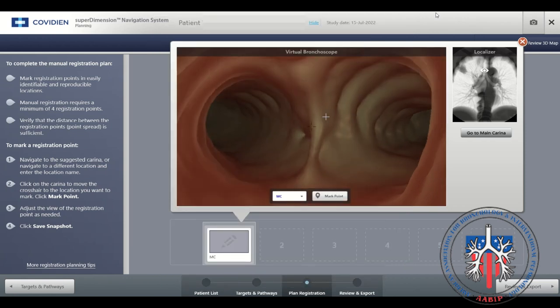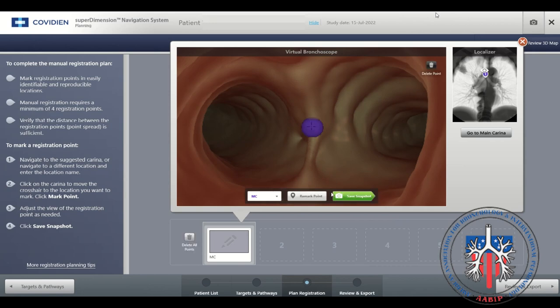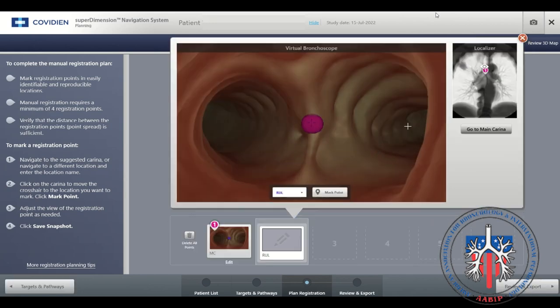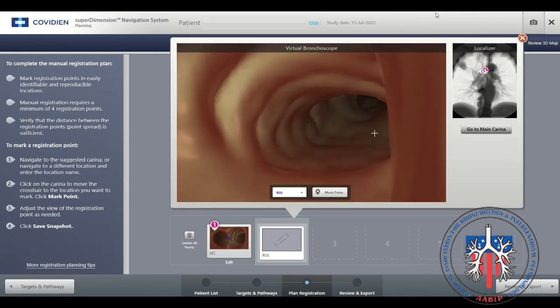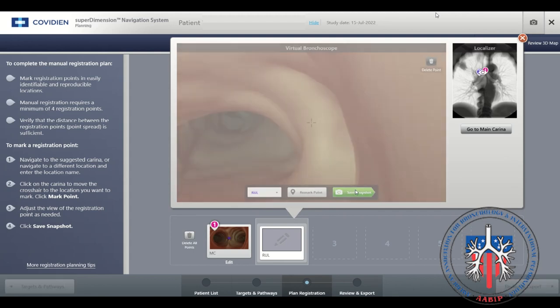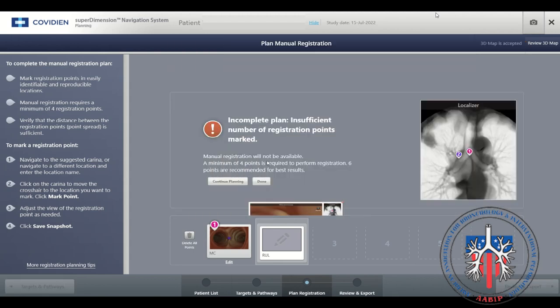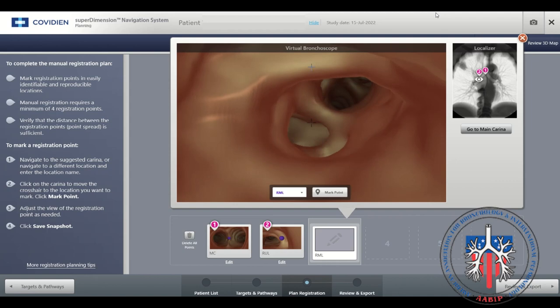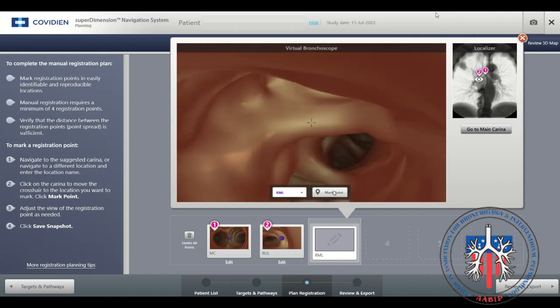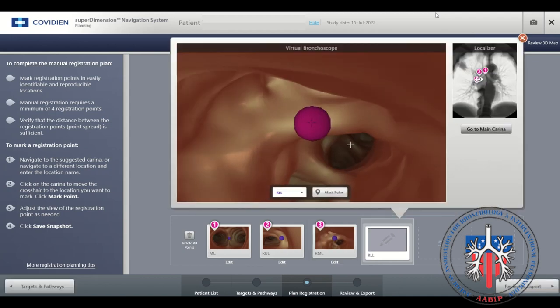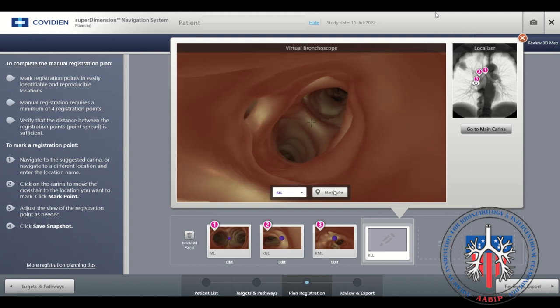The following points are marked in manual registration: main carina, RC1, RC2, and an easily visible lower lobe carina.